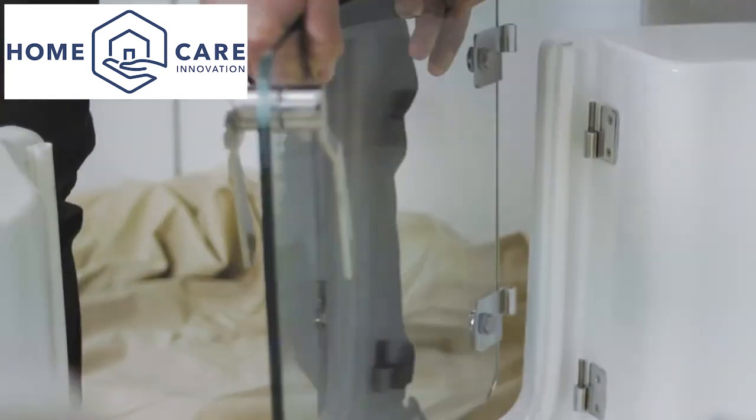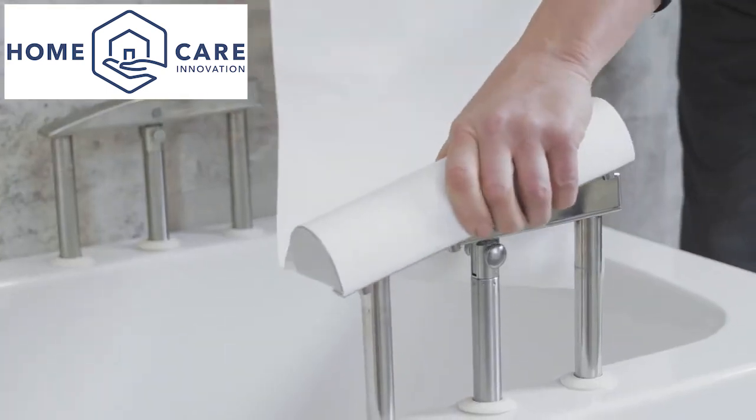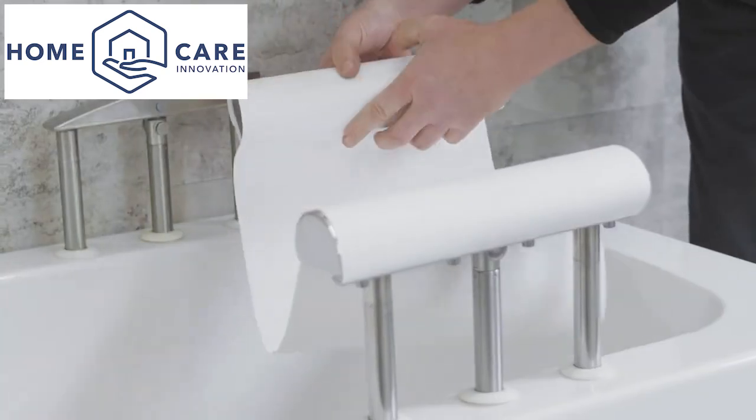Once all pipework and electrics are connected, refit the door and seat. If your bath was ordered with a fabric seat, now is the time to fit this, as shown here.